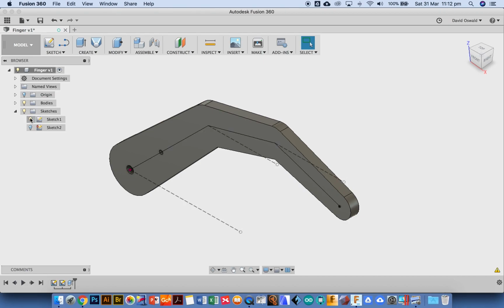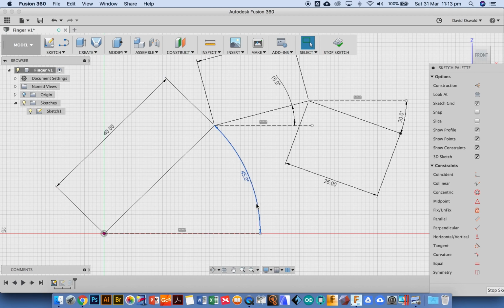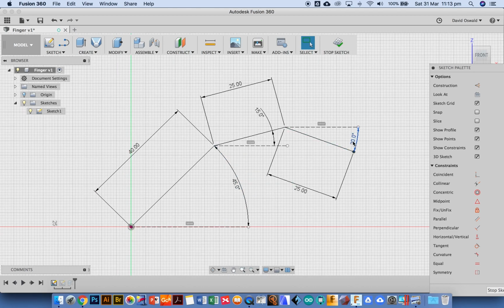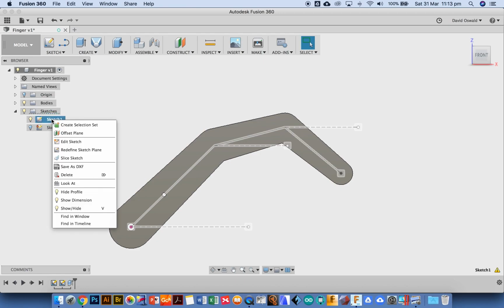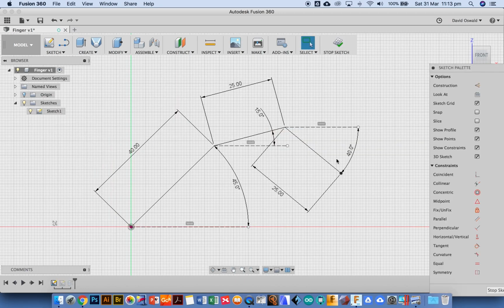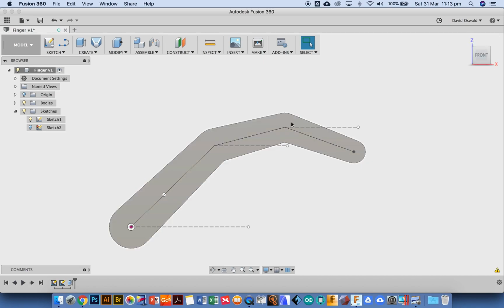But just to prove a point with being able to manipulate this finger now, if I go back to here and I go edit sketch and I go, okay, no, I don't want 20, I want 40 degrees there. Tip of the fingers move down, same length. Back here, you notice that the tips move down. Again, if I had to control it, edit sketch, I'm going to take it back to the 20 that I had. I can control the shape of that finger perfectly by controlling that line that goes through the middle.